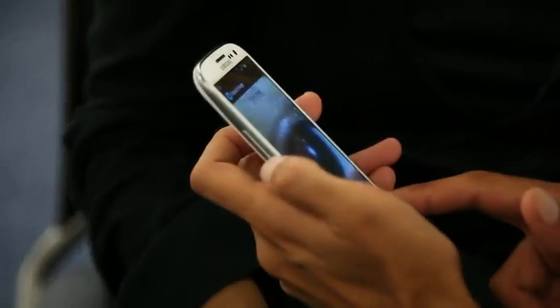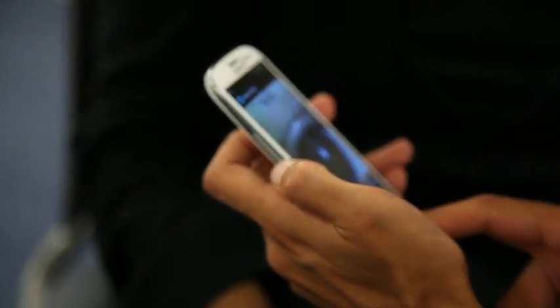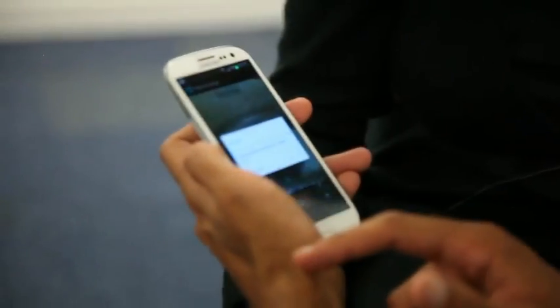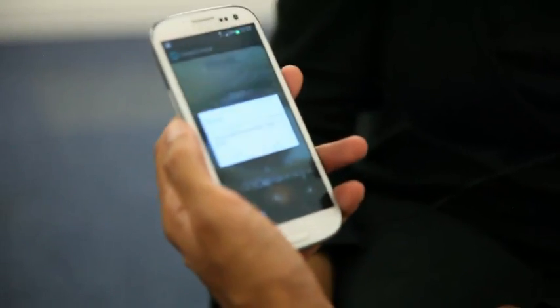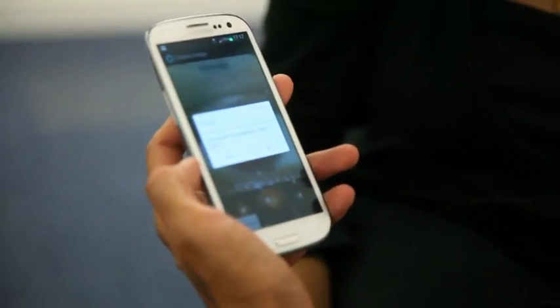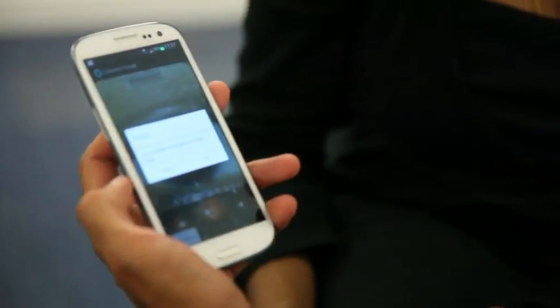Now what I would then do is zoom into the picture, and we see a carousel of images to compare against. What we do is select the one that you're most similar to. So it requires the user to actually be making the comparison.